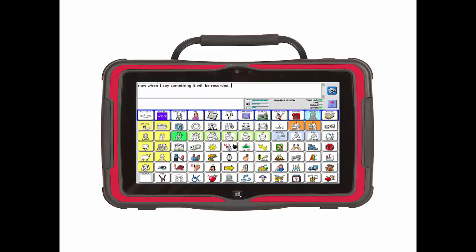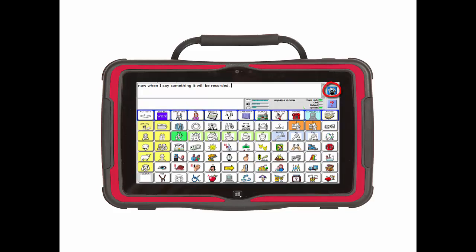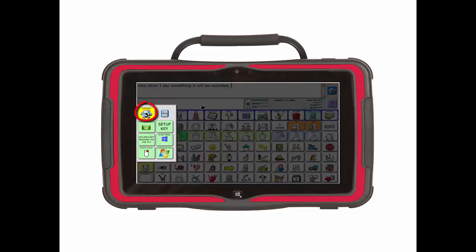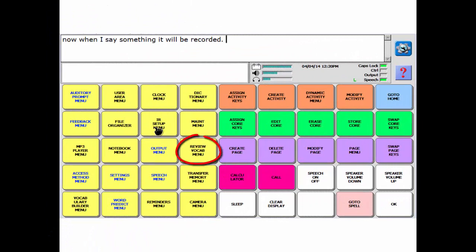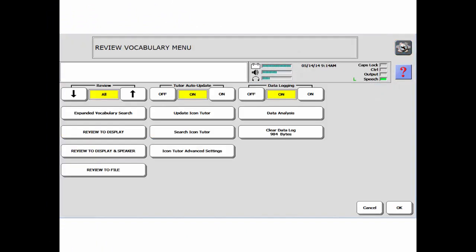Now that I have a small sample, let's save it. Head back to the toolbox and Review Vocab Menu. I can see I have collected 984 bytes of data with that sentence.